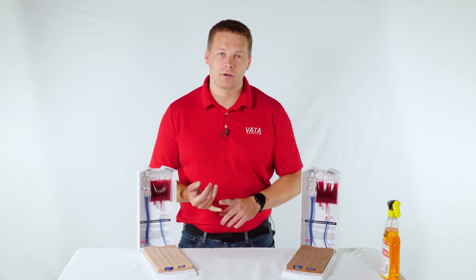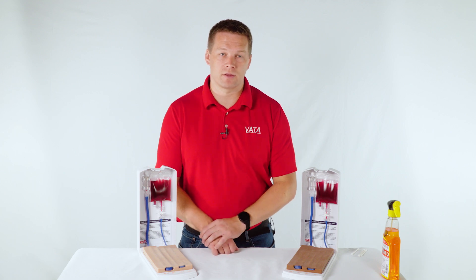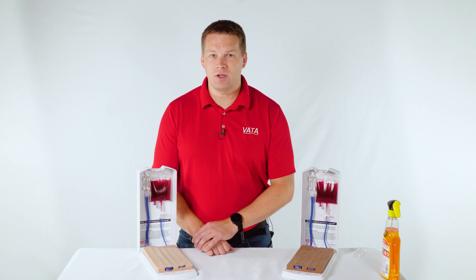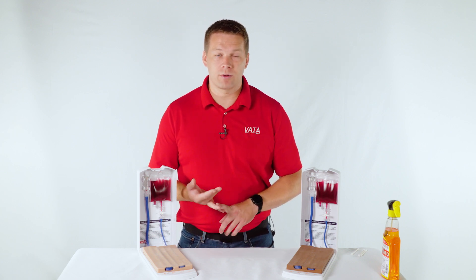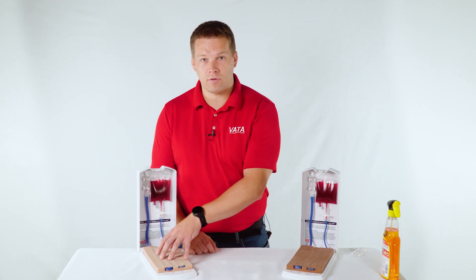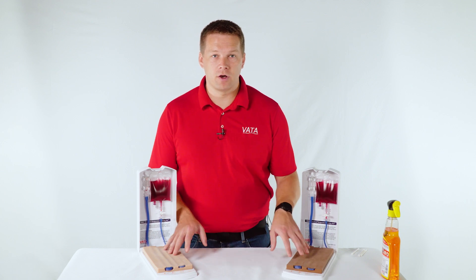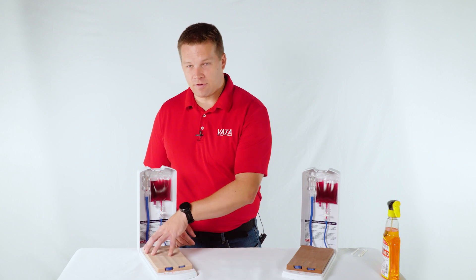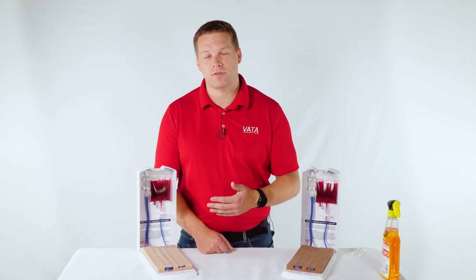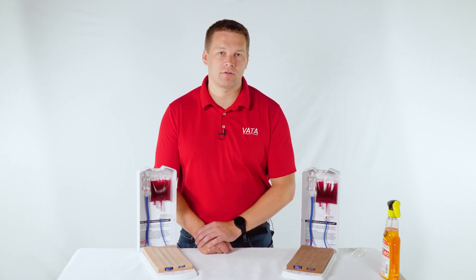Another common question is whether this model is ultrasound-compatible. No, it is not — you cannot use ultrasound on this. We'll go over our ultrasound models in another section on our website. The next question is what to do when the skin and veins need to be replaced. Some people just buy a new model, but we recommend buying the skin and vein replacement kit: part number 2381 for the light model and 2382 for the dark model. You'll get a skin and vein together plus a small tube of glue. It's about a five-minute process to replace them and you'll save quite a bit over buying a new model. We also have a video on the product pages for both models showing that replacement process.